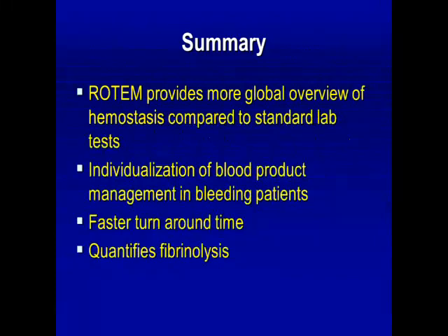So overall, to conclude the talk, ROTEM gives you a more global overview of hemostasis compared to previous coagulation testing, INR and PTT, that type of thing. It allows you to see the clot formation in real time, and it allows you to individualize the blood product management a bit more in a patient who's bleeding.